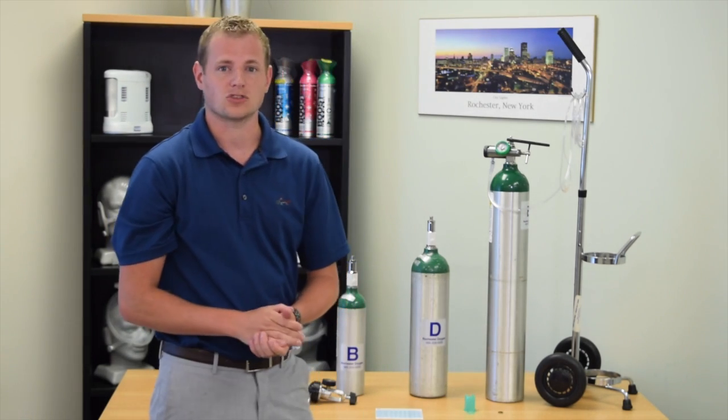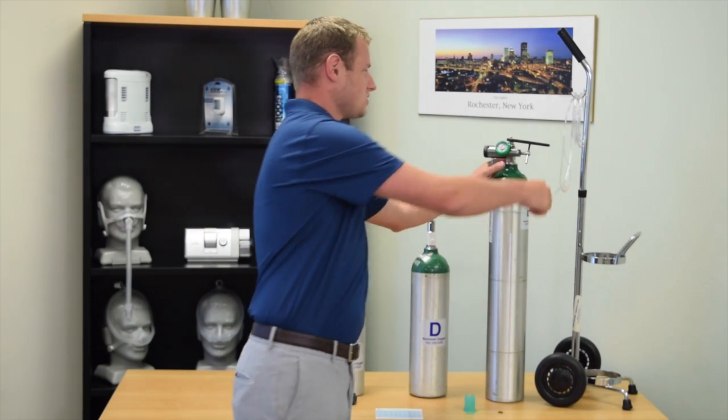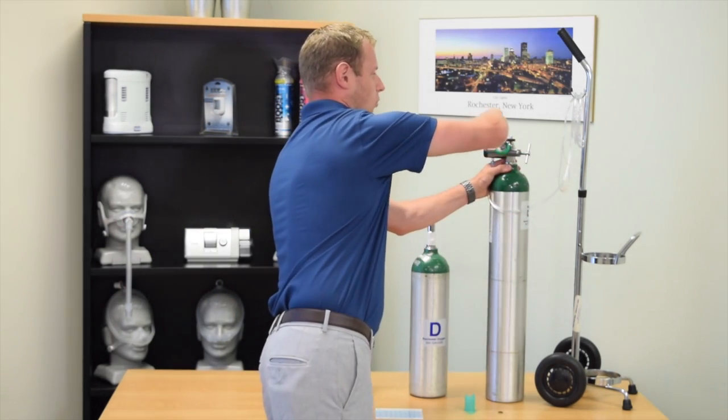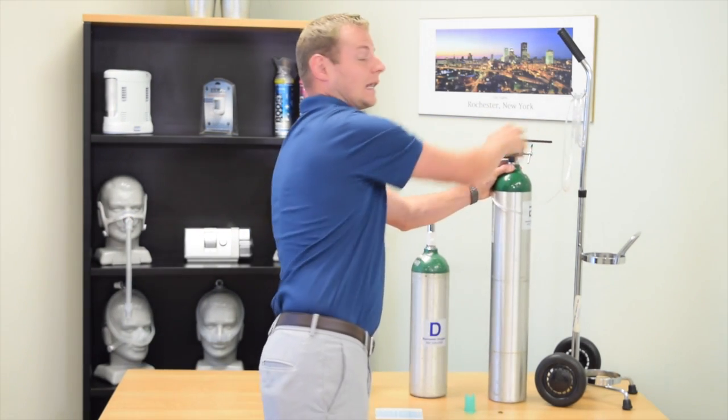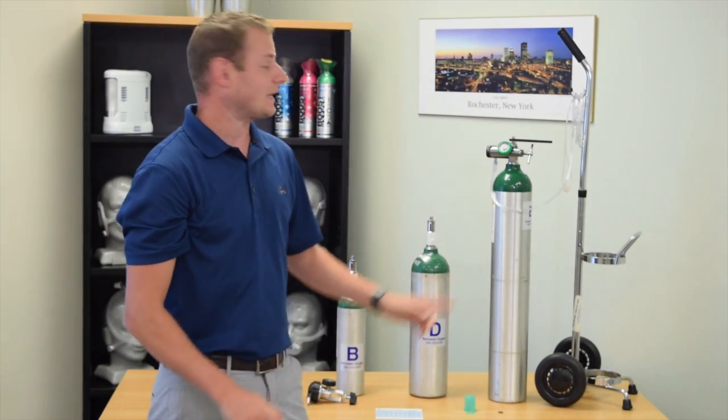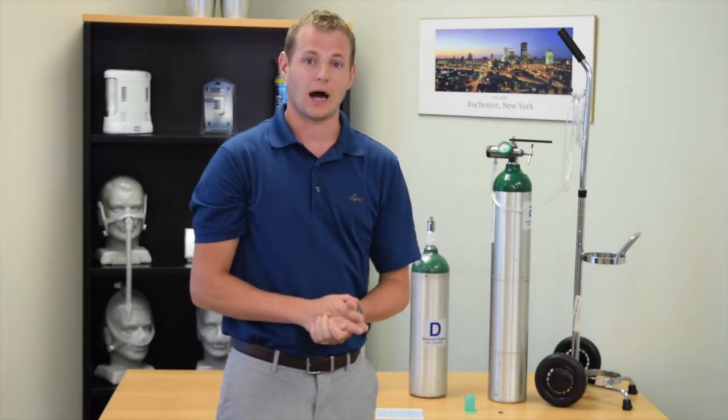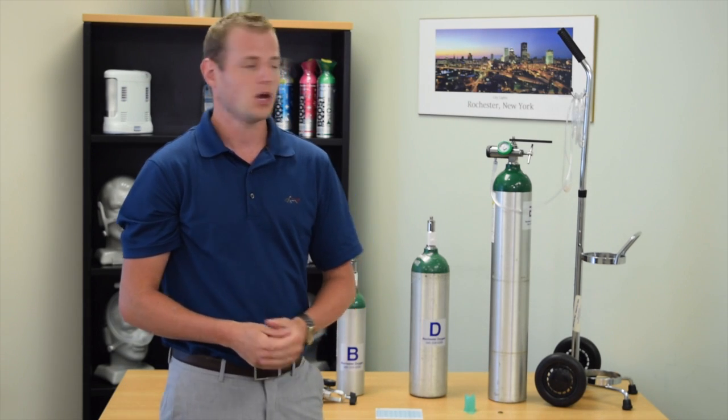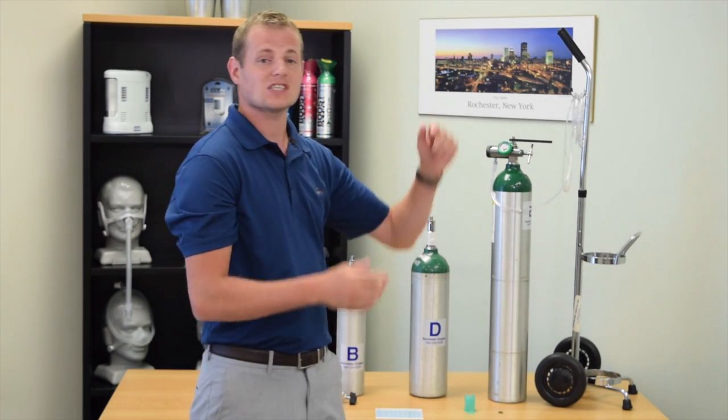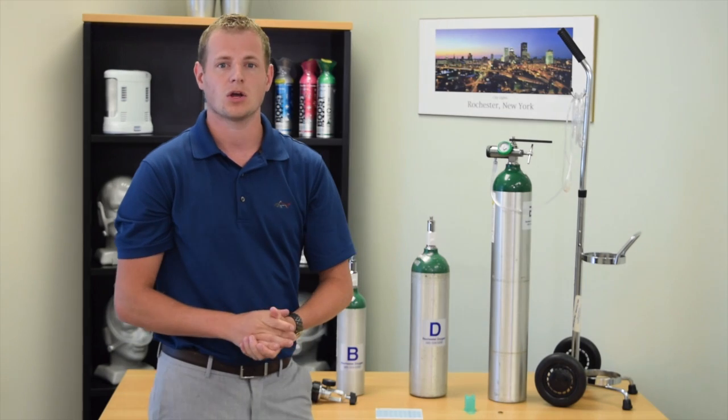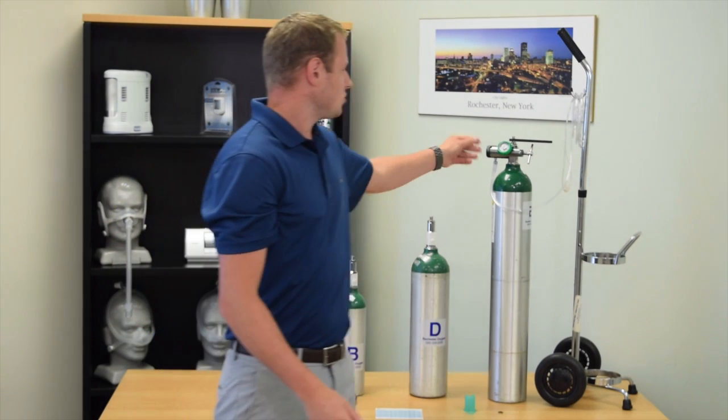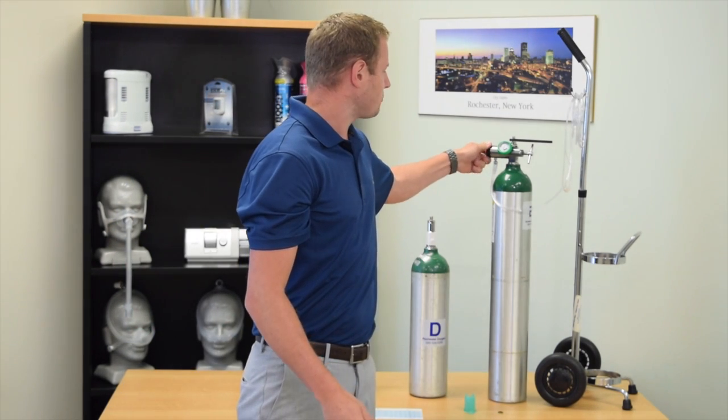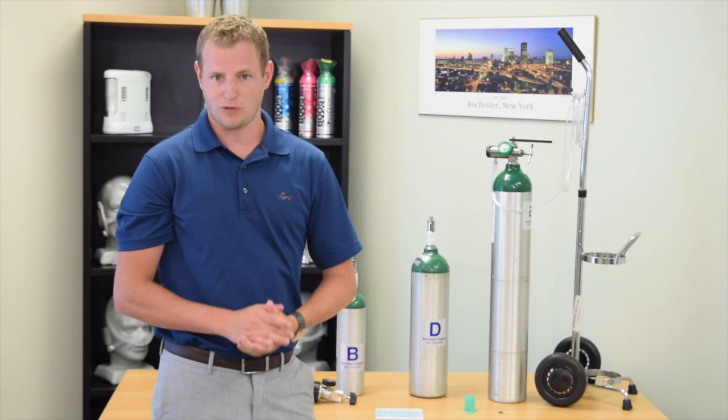When you are done using the oxygen, you can simply twist your tank wrench one full rotation in the clockwise direction, but leave your liter flow on to allow the oxygen to bleed through the regulator. Once your regulator dial reaches the red zero mark, you are then safe to turn your dial to the off position and remove your regulator.